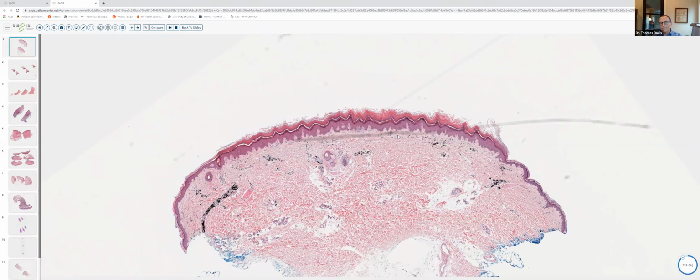We'll go ahead and move on to slide 3. Slides 3, 4, and 5 are dealing with a similar response, similar condition, similar iatrogenic agents, I should say. And in this particular specimen, we have an incisional biopsy. This is from the trunk or proximal extremity.